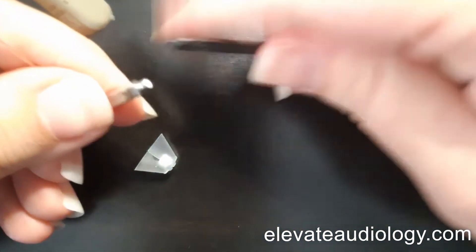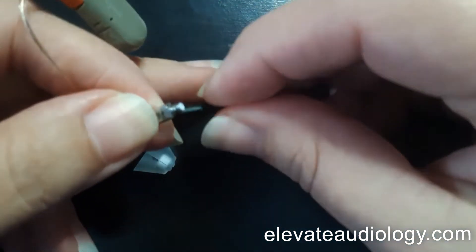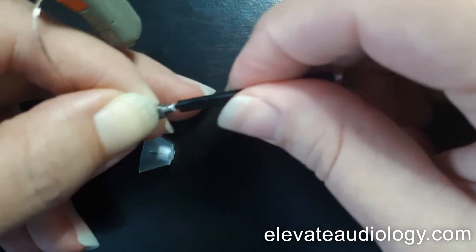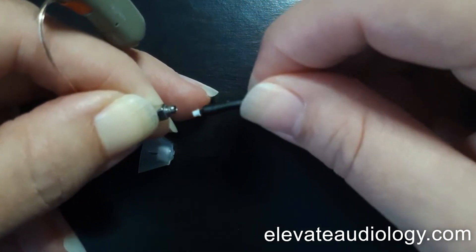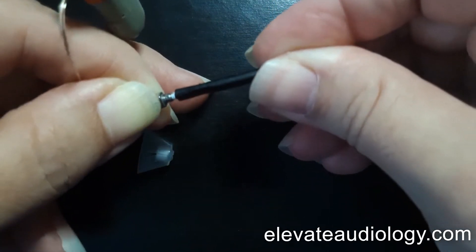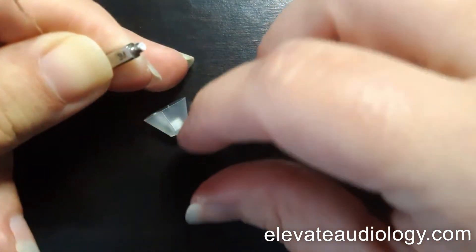Then to change the wax filter, take the new wax filter. On the other side, you're going to go ahead and screw in that side and pull it out. You'll then brush all of this off with a hearing aid brush or a soft bristle toothbrush. Then flip it over, straight push in, straight pull out, and that new filter will stay in place.